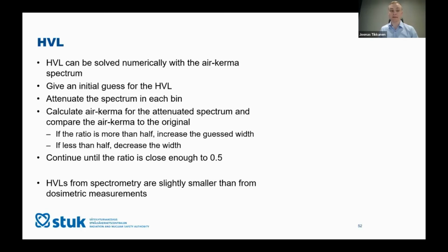And just a note, for some reason, these HVLs from spectrometry are slightly smaller than from dosimetric measurements, so measurements with an ionization chamber, for example. And there has not been a good answer yet to why this is.